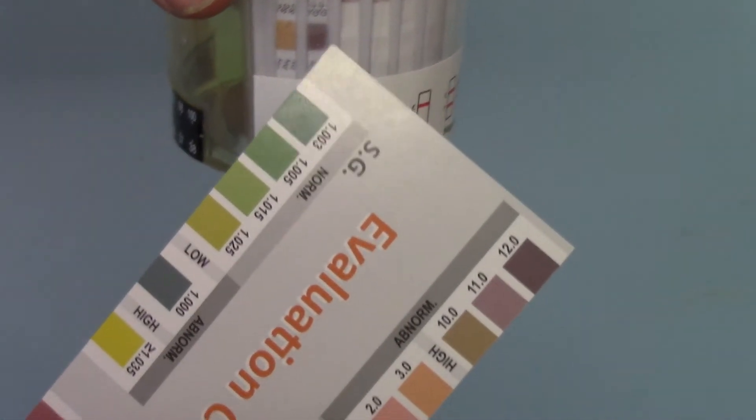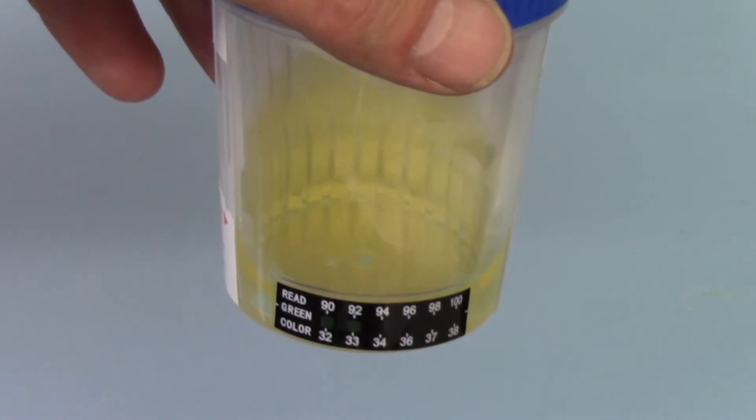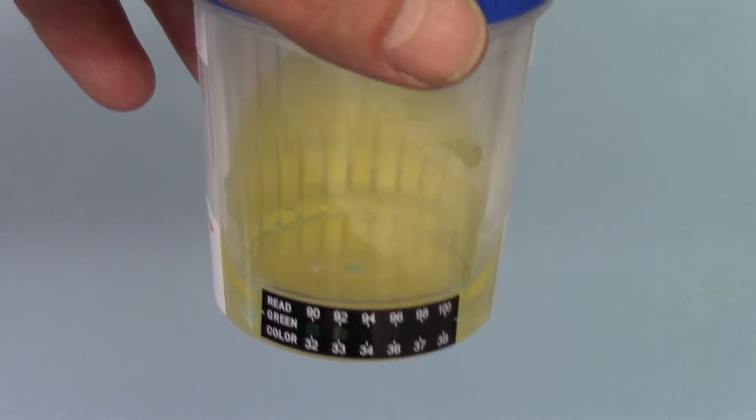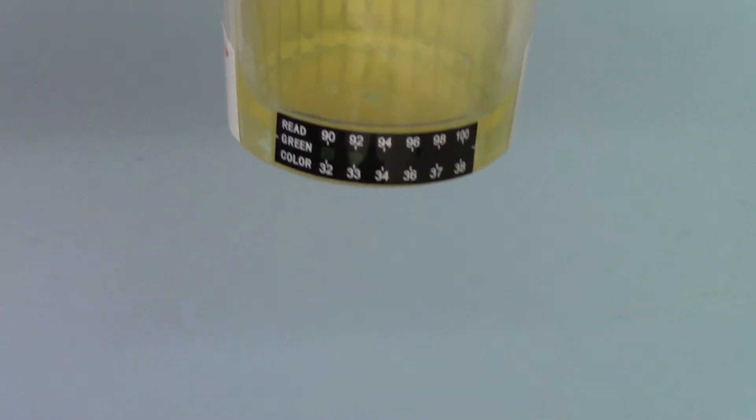If they are all negative or normal, that's reassuring that the sample that's been placed into this cup has not been adulterated or diluted and basically meets the parameters for normal strength healthy human urine.